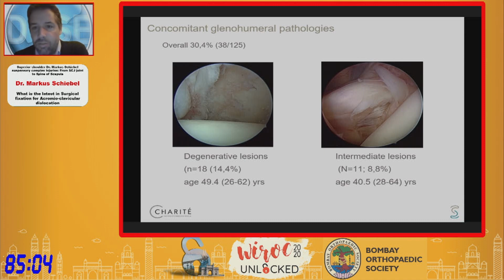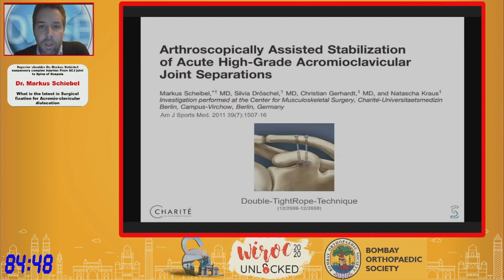So this is just to describe, because we don't really know if we have to treat these patients. But if you do it arthroscopically, of course, you are tempted to treat these injuries, even if the patient has no symptoms preoperatively. So what about stabilization methods?